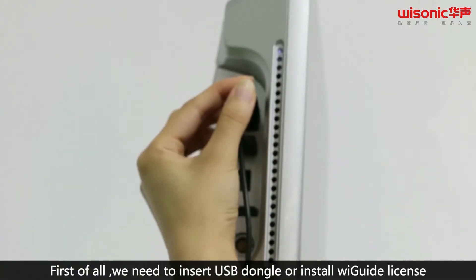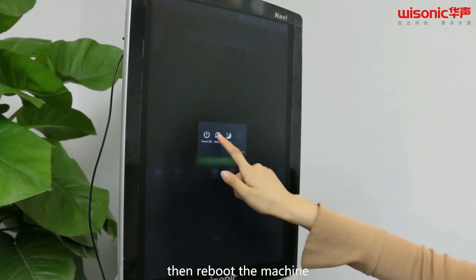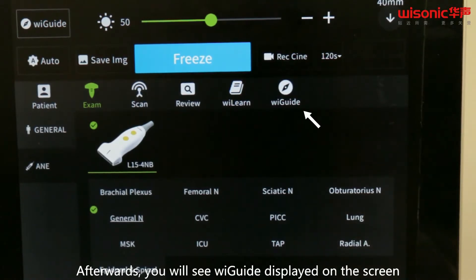First of all, we need to insert the USB dongle or install wiGuide license, then reboot the machine. Afterwards, you will see wiGuide displayed on the screen.